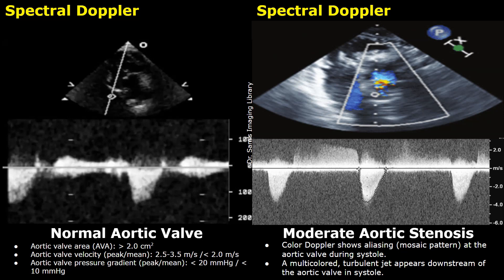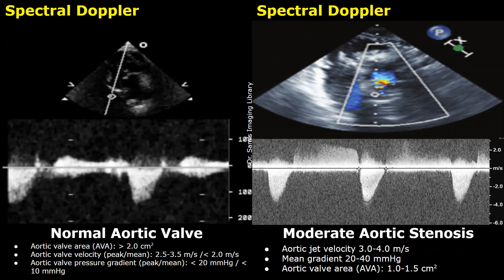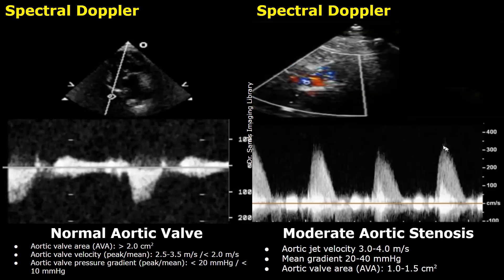In moderate aortic stenosis, you may find color mixing or a mosaic pattern at the aortic valve during systole, and a multicolored turbulent jet appears downstream of the aortic valve. On spectral Doppler, the aortic jet velocity is between 3 and 4 m/s. The mean gradient is 20 to 40 mmHg, and the aortic valve area is 1 to 1.5 cm². Here is another example of moderate aortic valve stenosis where the peak velocity on spectral Doppler is just above 3 m/s, confirming moderate stenosis.